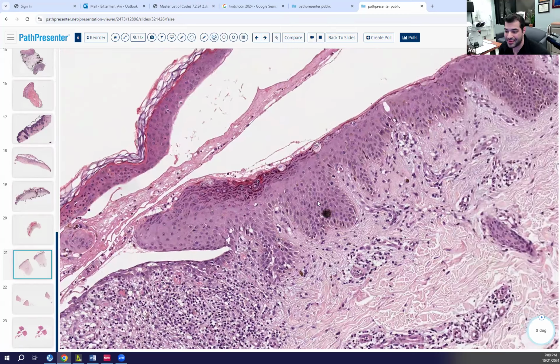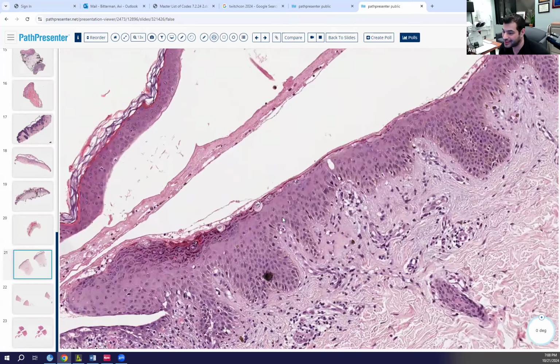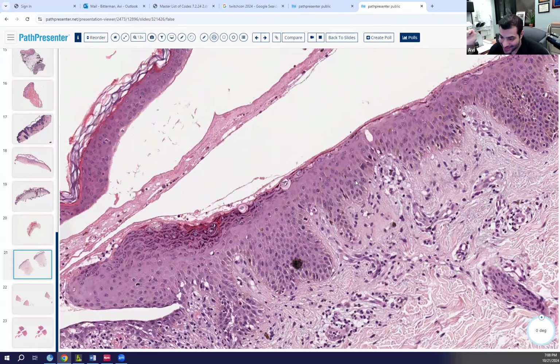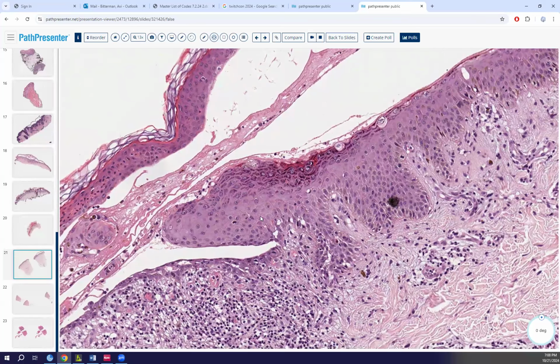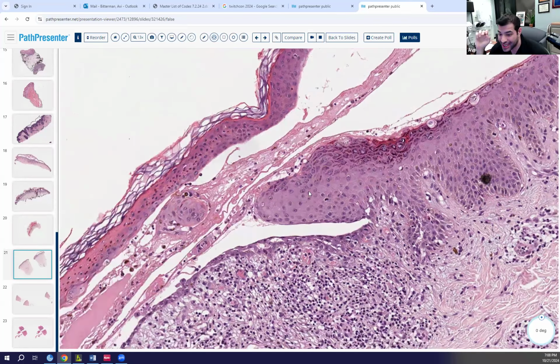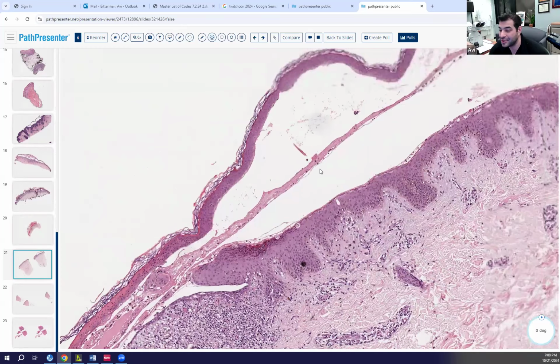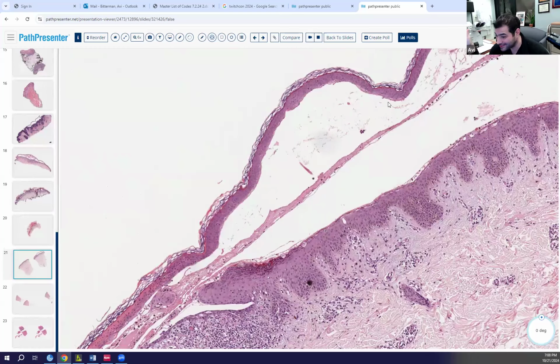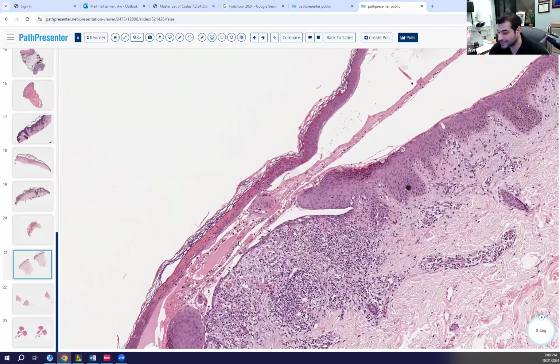This is IP. So in IP we see eosinophilic spongiosis, right? So we would have eosinophilic spongiosis plus dead reds, and also dyskeratosis, dyskeratotic keratinocytes. But what if we see instead of that an intraepidermal split with dead reds?